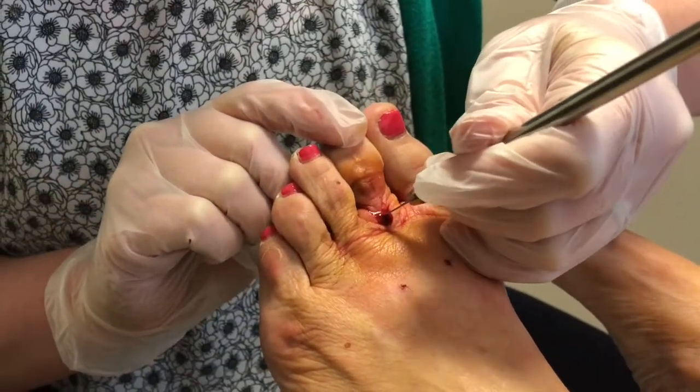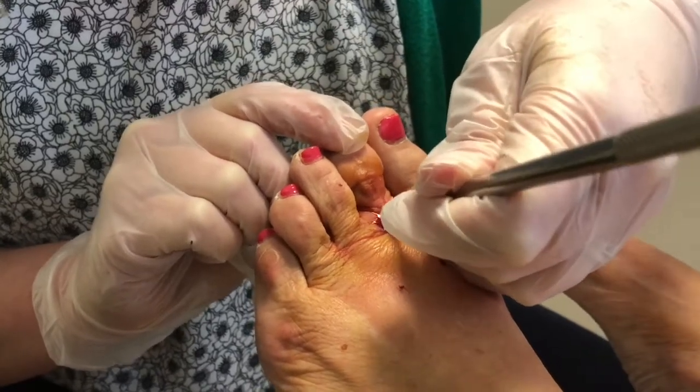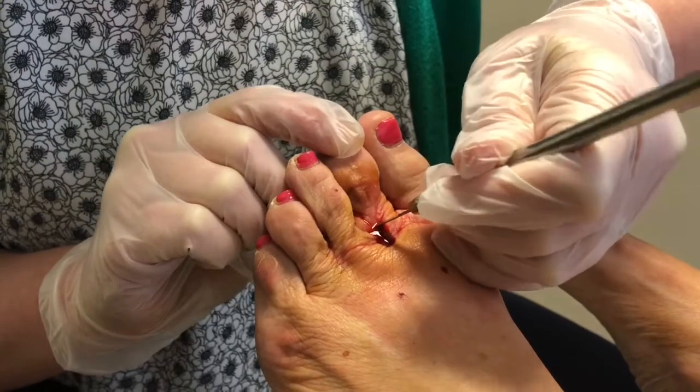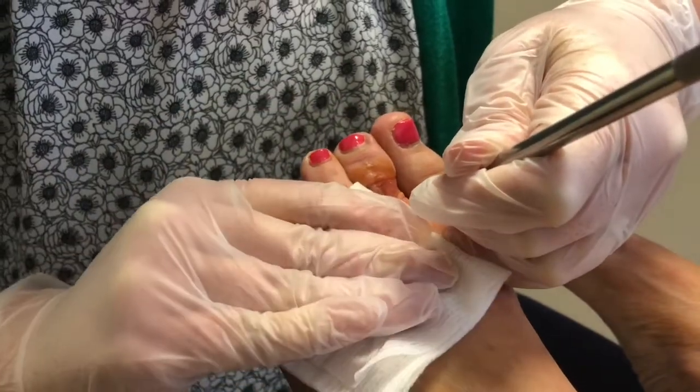I'm going in through a small incision and getting all aspects of the extensor tendon and the joint capsule surrounding this joint, which is called the metatarsal phalangeal joint — and that's it, just that small incision, a little blood.